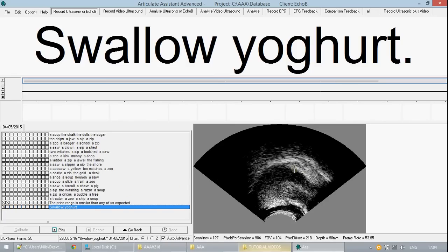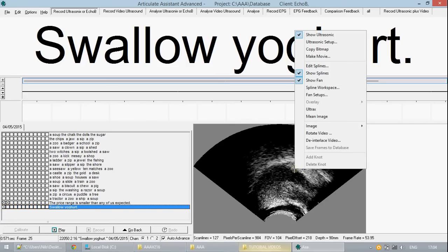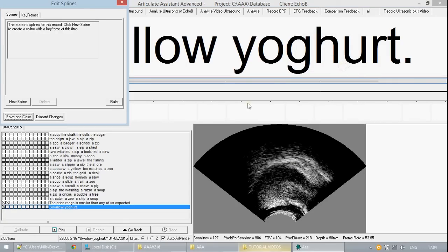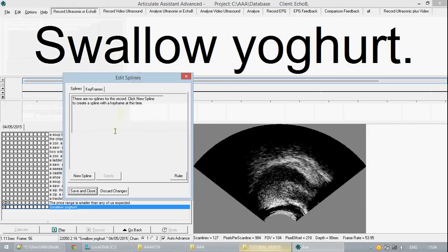To begin with editing splines you can go into the right-click menu for the ultrasonic image and go to edit splines. This will bring up a dialog box.